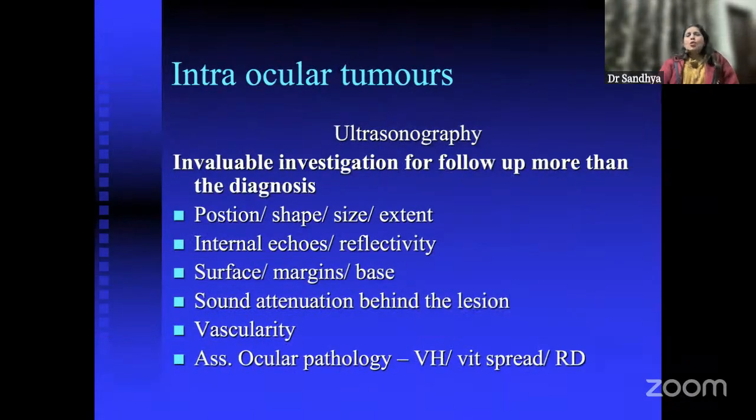Okay. So next we come to intraocular tumors. Now, ultrasound is very important. In fact, I would say it is most important. It is an invaluable investigation of choice. It is more for follow-up rather than diagnosis. Diagnosis, definitely we will do with ultrasound, but it is more important for following up the patient.